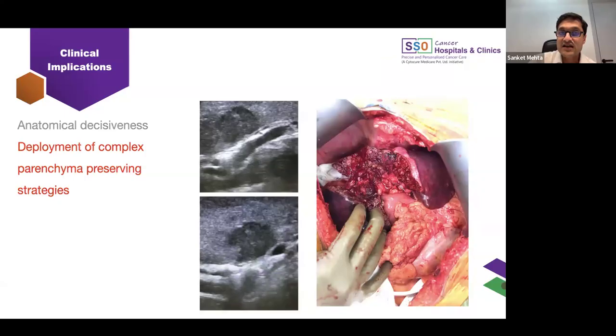And as we discussed while we are seeing the video of the Glisson capsule, using R1 vascular principles and using intraoperative ultrasound, you can do conservative resection, remove this disease while preserving the Glissonian pedicles. This patient went on to live for another 4.5 years, had another liver resection, and then died of brain metastasis. So you can go from a completely inoperable patient to a patient who is surviving for 4.5 years. That's the impact of intraop ultrasonography.